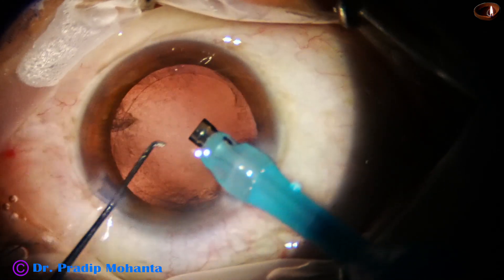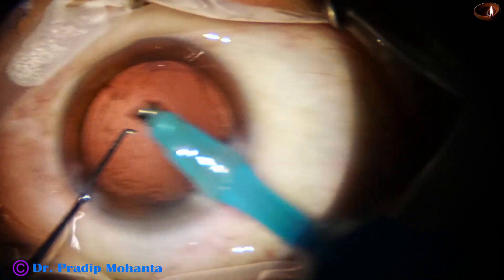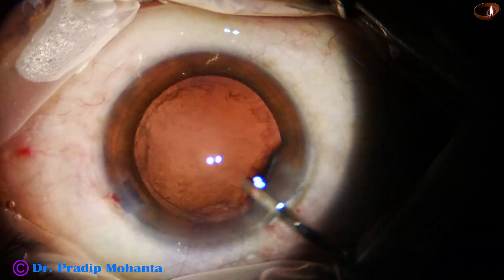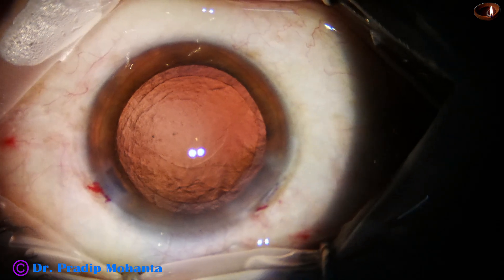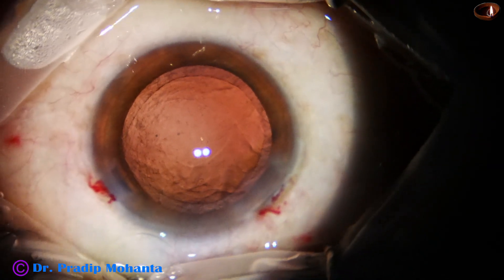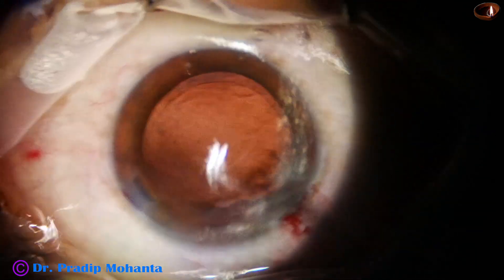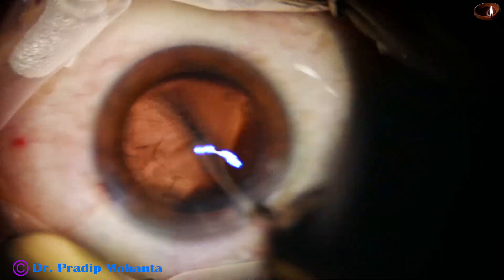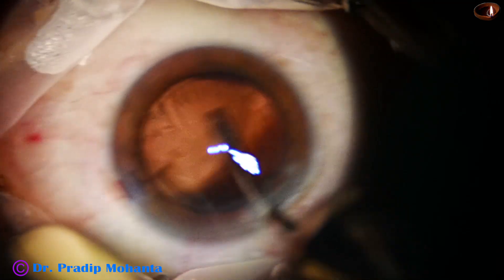So we have to have patience. We have to hold the nuclear material with the phaco needle, use the chopper to detach the epinucleus, keep it at a distance, and then emulsify the nuclear material. If we do this, the protection of the posterior capsule is very good, and posterior capsule rupture will be a thing of the past in your surgeries.